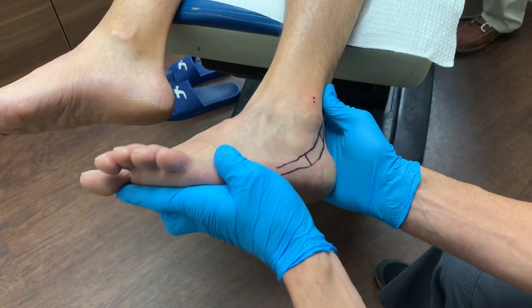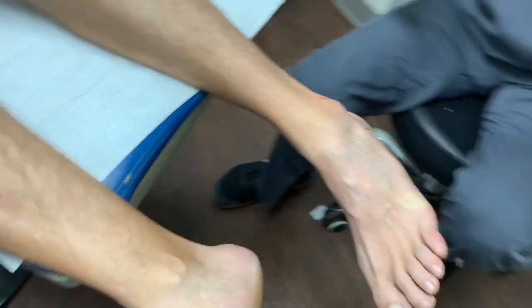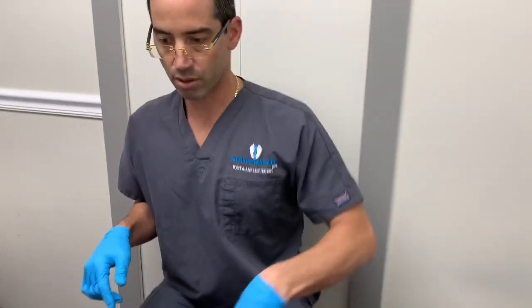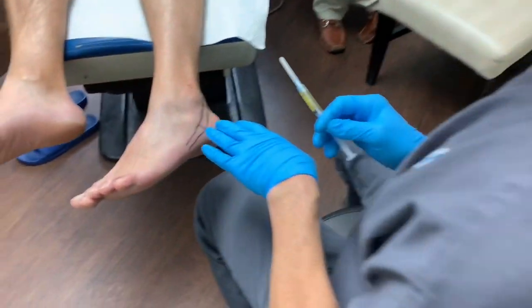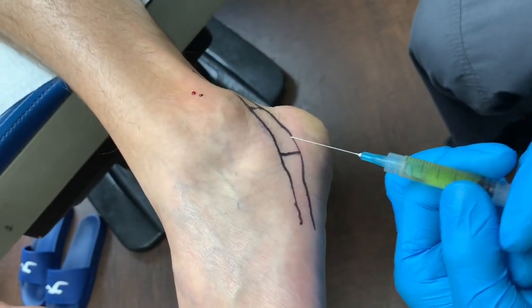When you compare them — and we will compare it to the other side — I'm going to inject a little bit on the right as well. Let's get a really nice close-up here. Make sure we get a good close-up. Okay, I'm going to come in.